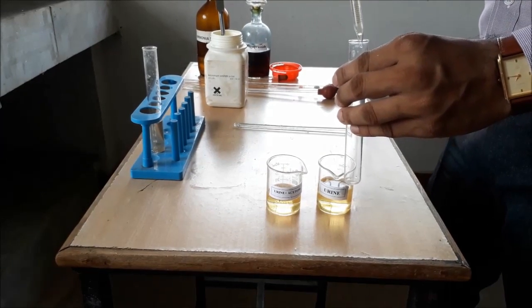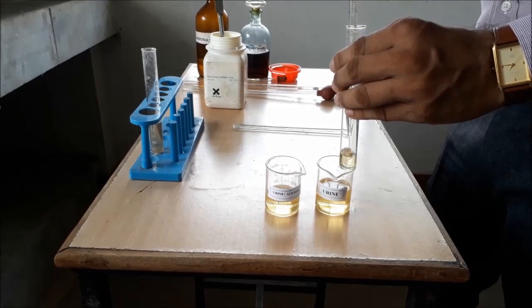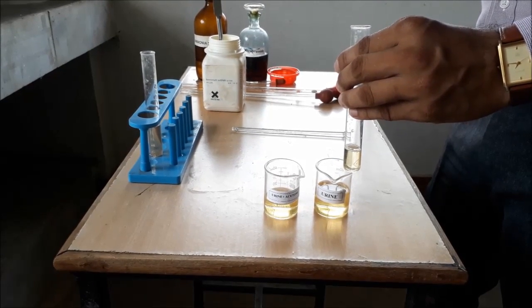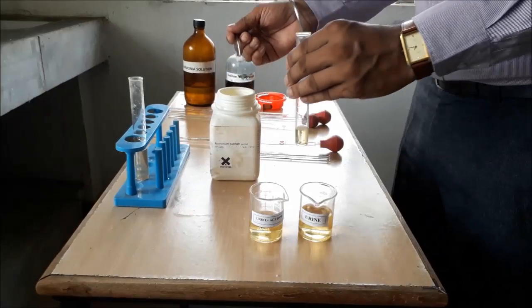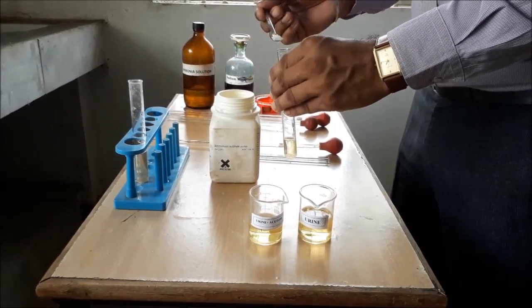Now, we are doing the same procedure with a given sample of urine. We do not have any positive sample of urine. Thus, we have added acetone with urine to mimic the presence of ketone bodies.